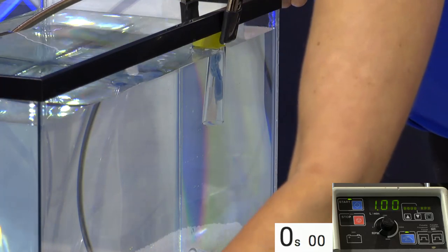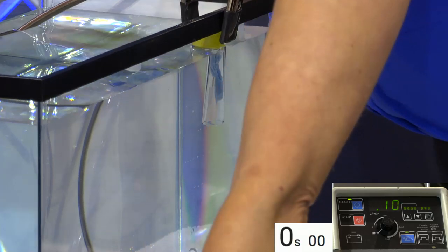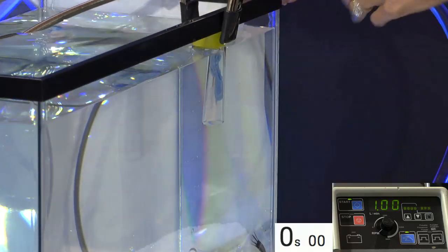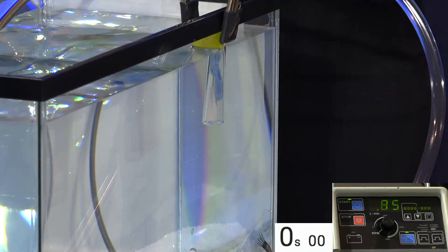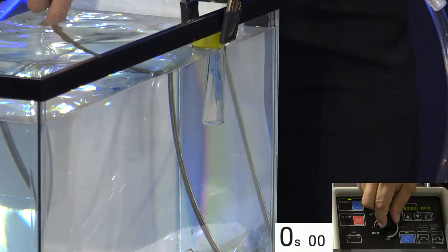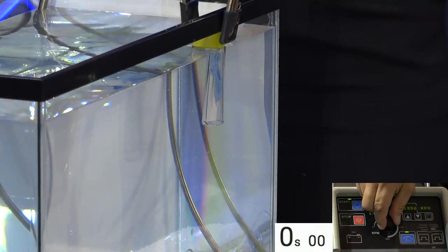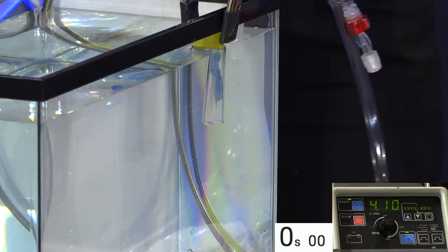And squeeze. Oh, here, I have to open this. Yeah, clamp that. Squeeze. Keep squeezing. If she's getting a little air in, it's probably because the back is not tightened down around the cannula. Let me go back on. And so it may be pulling some in. Tighten it around the outer cannula.